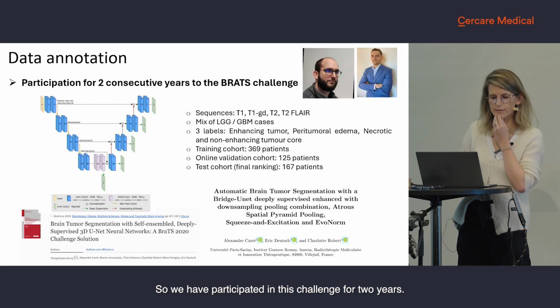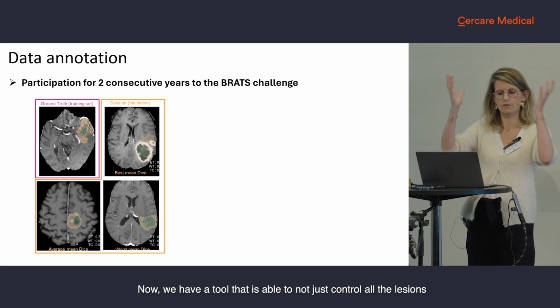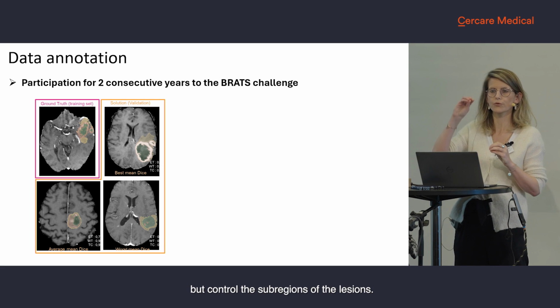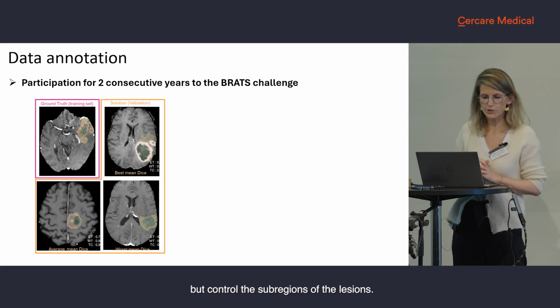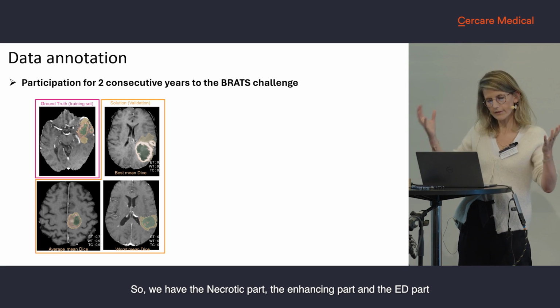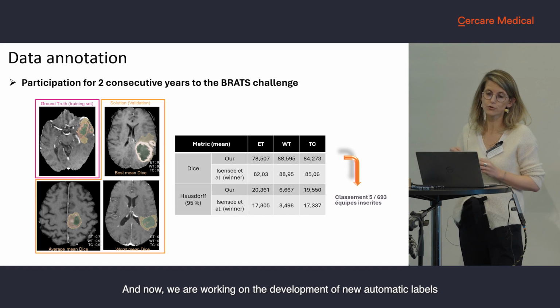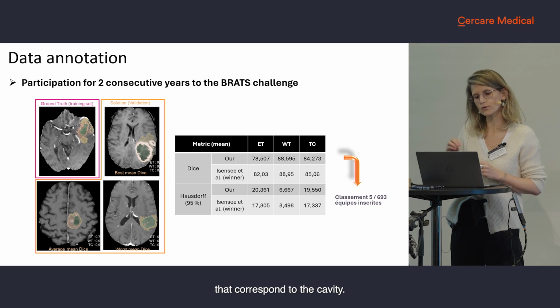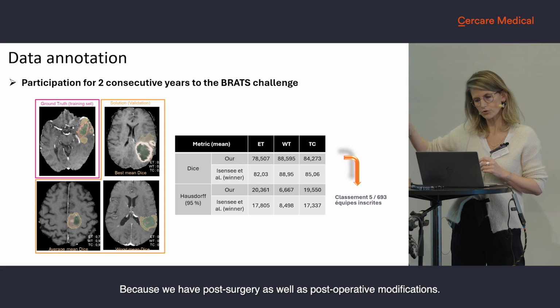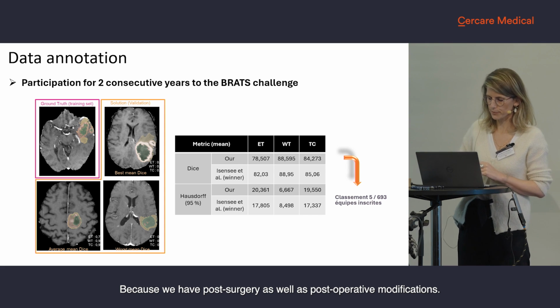So we have participated in this challenge for 2 years, and we now have a tool that is able to not just contour all the lesions, but contour subregions of the lesions. So we have the necrotic part, the enhancing part, the edema, and now we are working on the development of new automatic labels that correspond to the cavity, because we are post-surgery, and as well post-operative modifications.